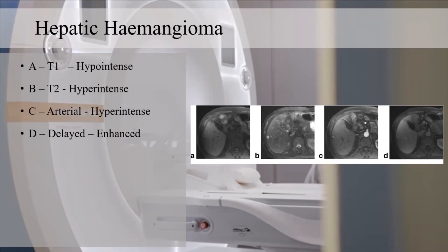After the contrast, the enhancement usually will be seen at 5 minutes or after 5 minutes. Now this is a delayed image, which shows enhancement. So the characteristic is that in hepatic hemangioma, contrast enhancement is seen in the delayed images.